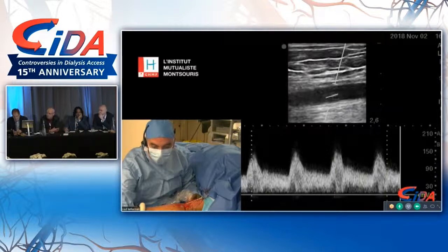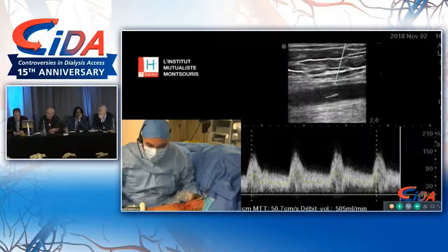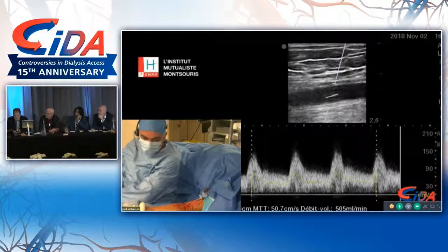And we do it in the OBL. So a patient will come in at 8 o'clock, and I do blocks myself. We'll use lidocaine, and the lidocaine wears off in about an hour. So the patients will come in at 8, and they'll leave by 9:30.